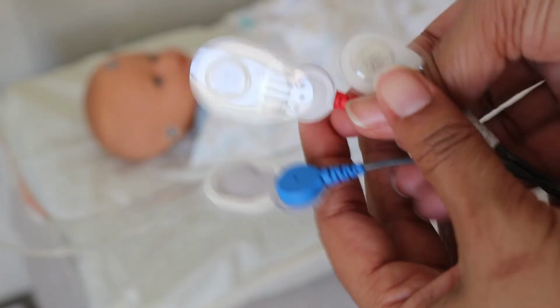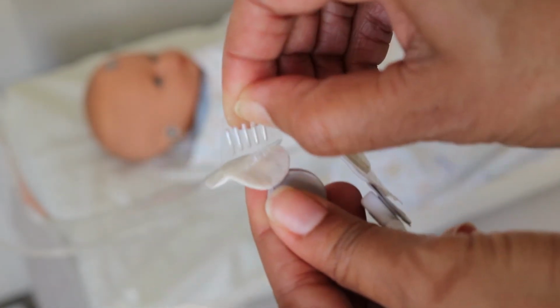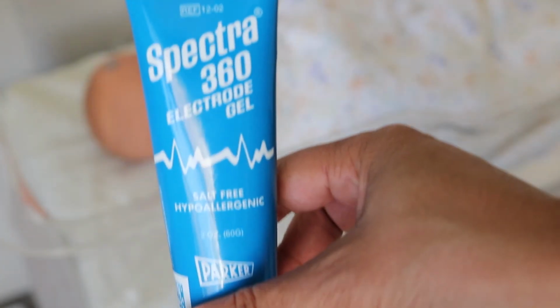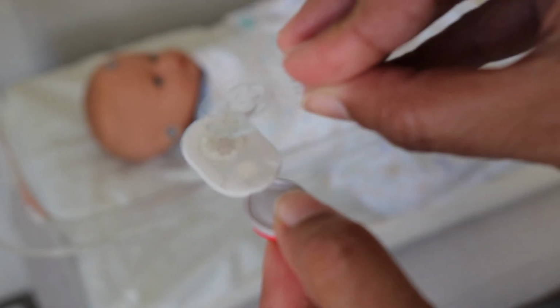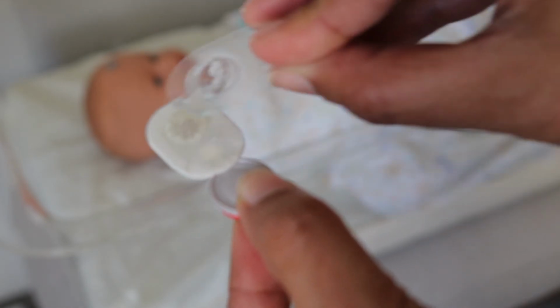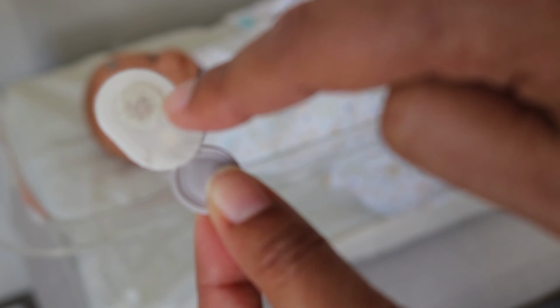To obtain the most ideal impedance, which is good contact with the skin, IHS recommends the use of SpectraGel in addition to the gel already on the electrode. Place a small drop of SpectraGel on a gauze pad. You can also use the backing of the electrode as a receptacle. Use a small dab of SpectraGel in the center of the electrode sponge.